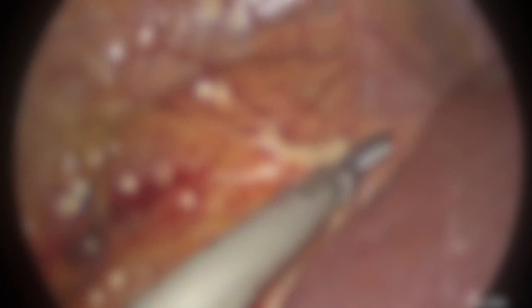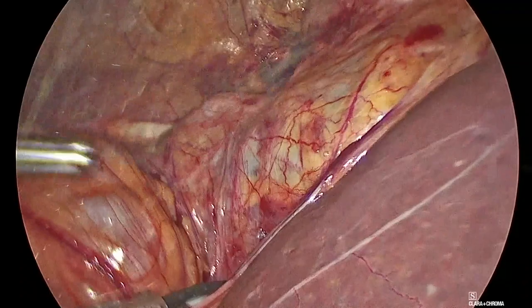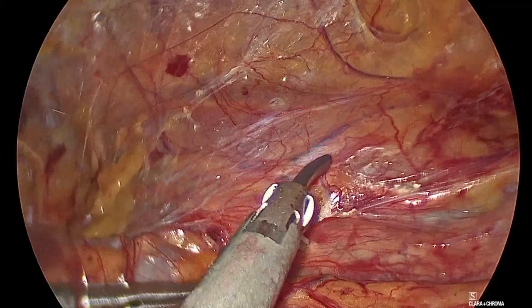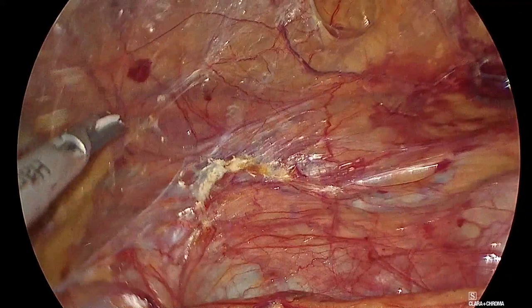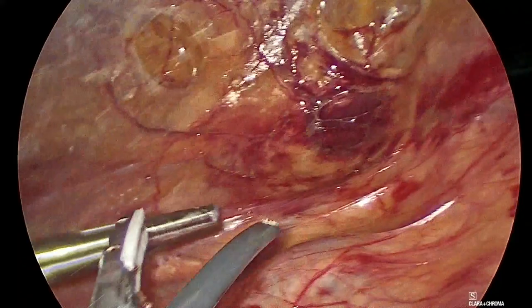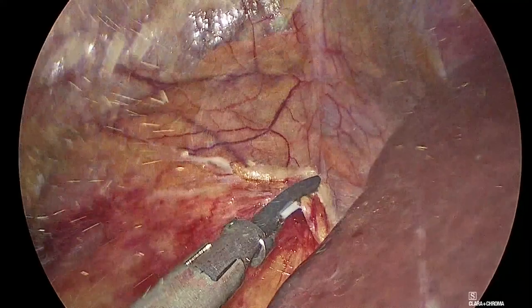Okay, so now you see, look here. This is the dilated pelvis. So the ureter is kinking over here and it's going all the way down. One thing that we need to be very careful about, although she's a very thin lady, is that we don't want to injure the ureter. One of the reasons why we're seeing more and more literature on whether we should or shouldn't do laparoscopic nephroureterectomies or laparoscopic or robotic cystectomies is because there is some evidence that there might be higher recurrence or peritoneal metastasis. And I think that the majority of the time, if you have such a seeding implantation, it is because you injured the ureter or you cut the lymph node, and then it's a problem. So whenever we have an injury to the ureter, which can happen, then we convert to open.